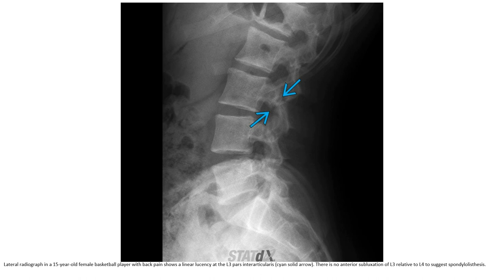This is a radiograph of a 15-year-old female basketball player with back pain. There is linear lucency at the L3 pars interarticularis. There is no anterior subluxation of L3 relative to L4 to suggest spondylolisthesis.